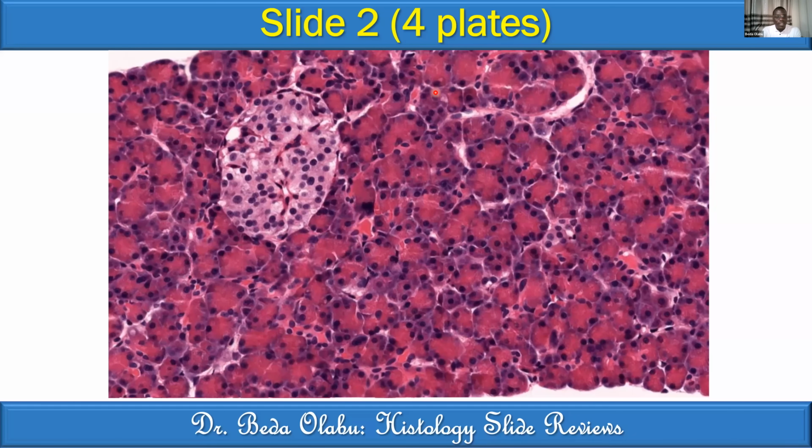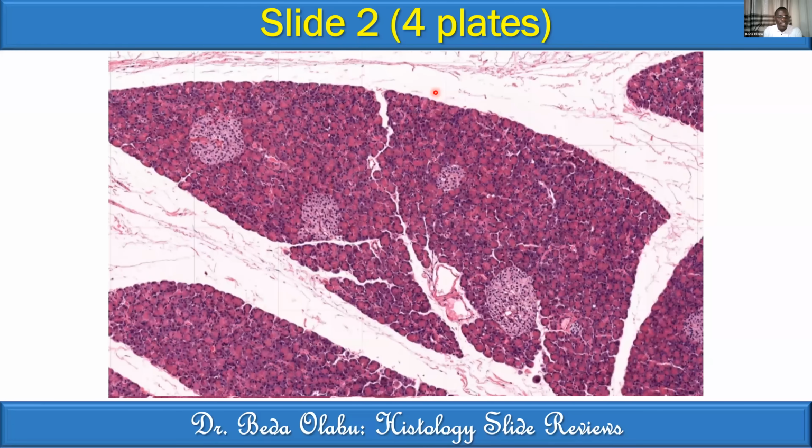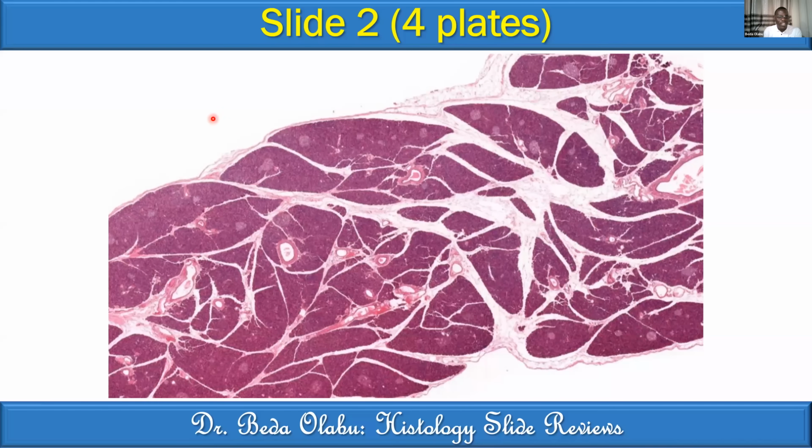All right, let me have another person before I give you a ruling. Any other person who also wants to try? We can start from first magnification, second, and the third. I think the third and the fourth are almost the same.